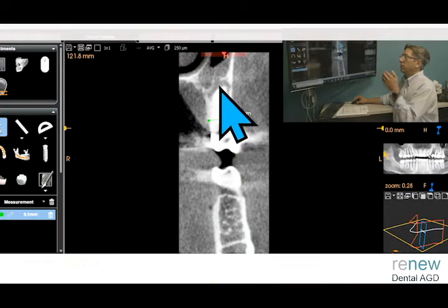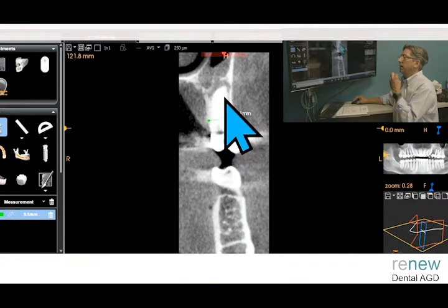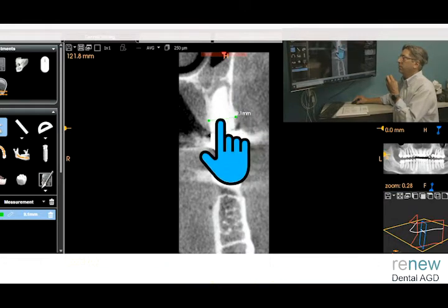You can get them from Salvin, and they have a little curved tip, kind of like a little bent spoon. That works well in this scenario where you can feel the membrane here or that cortical bone really delicately so that you feel this rubber bandy feel here. If you have that rubber bandy feel, you know that there's no bone there and that you better pack lightly everything you have that you can to save this bone height here. So that's kind of key.